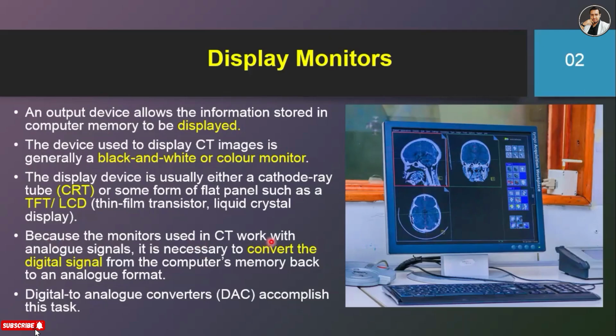Because the monitor used in CT works with analog signal, it is necessary to convert the digital signal from the computer memory back to an analog format.